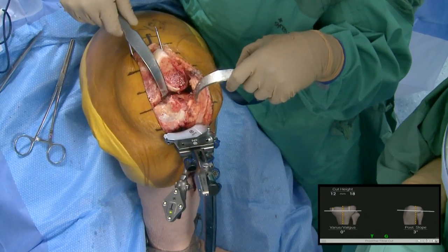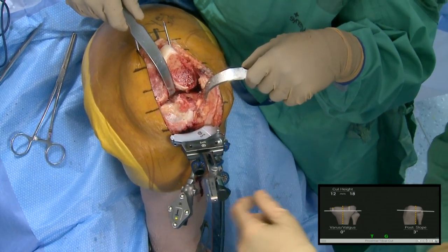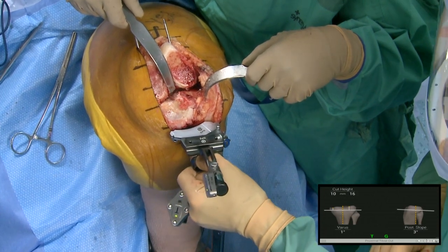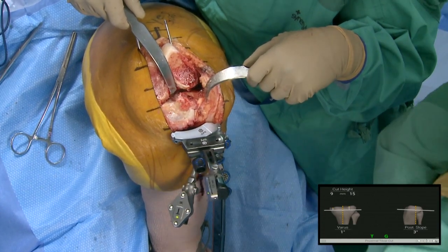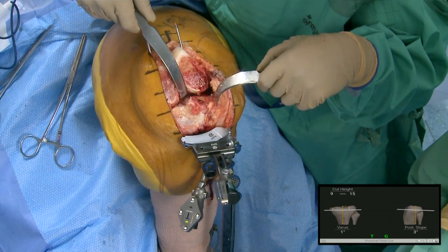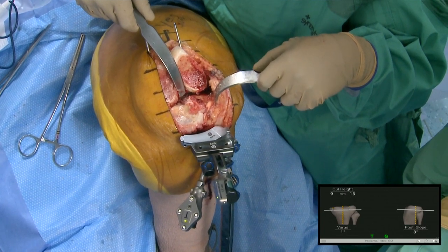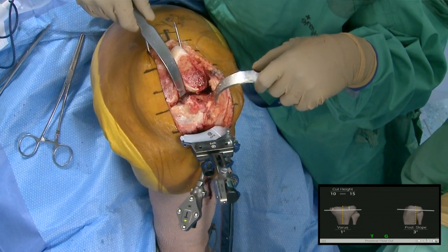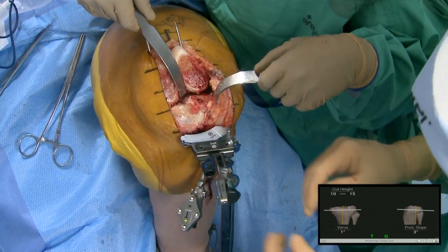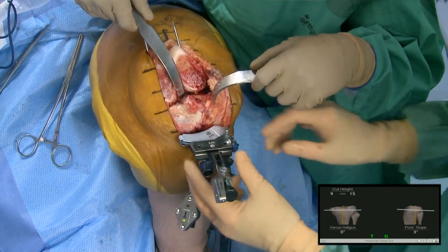Now I'm closer to 10-11 on the lateral side. The thinnest poly with the base plate is nine, so I'm usually shooting for about nine or ten on that lateral side. I'm a little bit better than I was. There was some wobble on the cut checker affecting the varus-valgus reading. Now we're bringing in the saw.